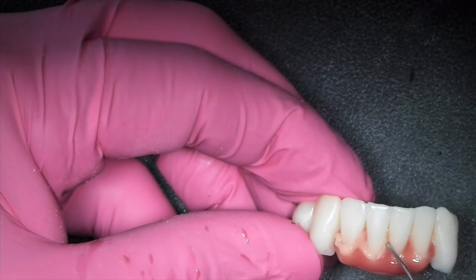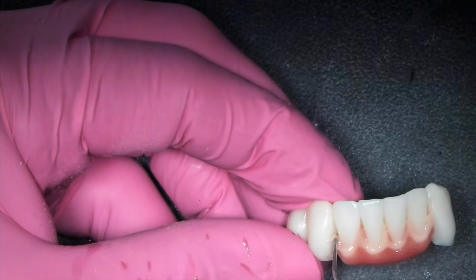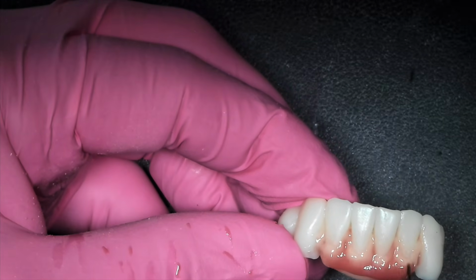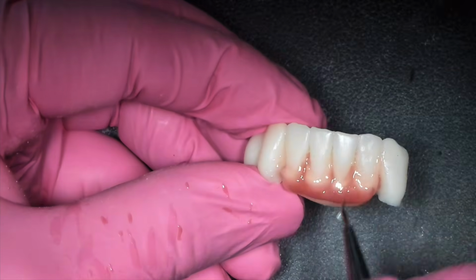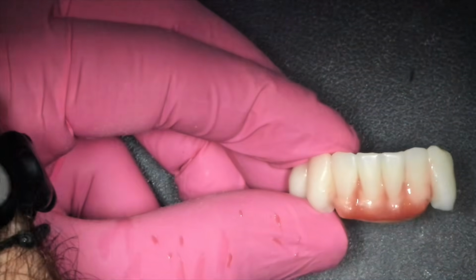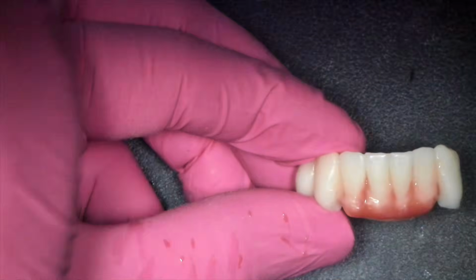So here's the margin color. They only have 2 colors as of this time to try to keep it easy. I do wish that they would have, I'm kind of a diva, I would like 10 different colors to do stuff with, but most people don't care about all that. They just want like 1 color.